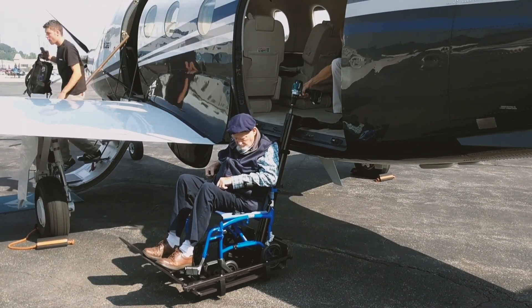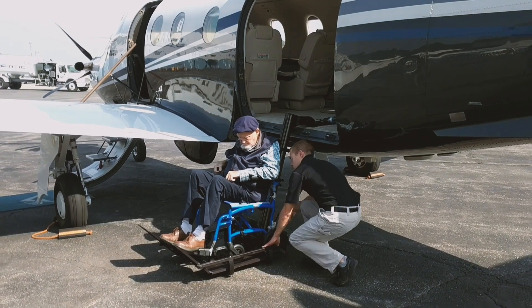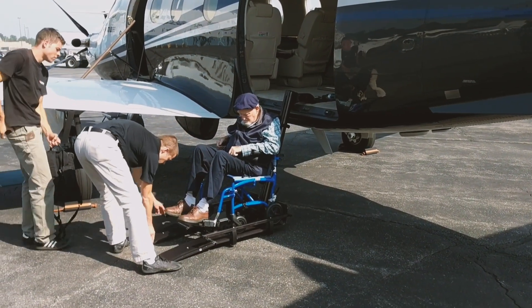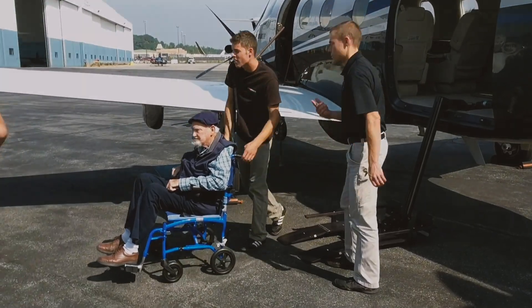Total system weight is about 57 pounds. While the lift is designed for the PC-12, it could be adapted to other aircraft with similarly large and easily accessed cargo doors. After applying for a patent on the concept, Clement has worked with ProStar Aviation in New Hampshire to manufacture and distribute the lifting device, which he calls the ProStar Lift.